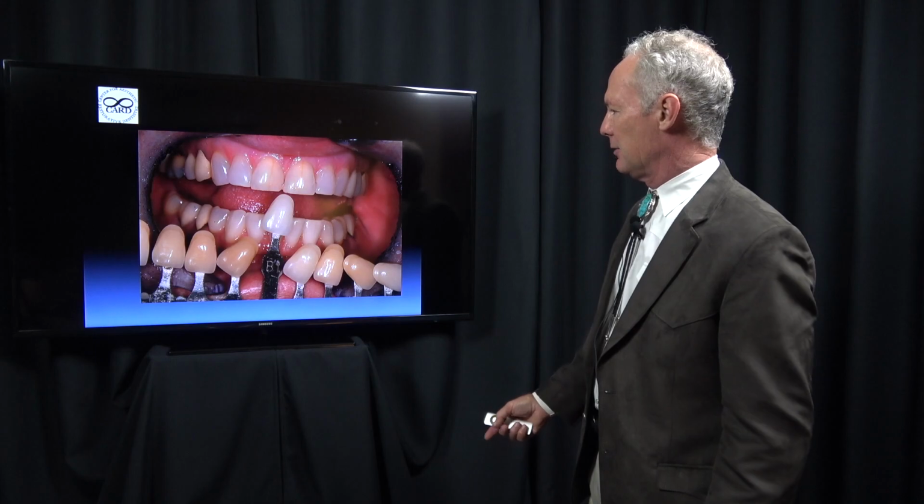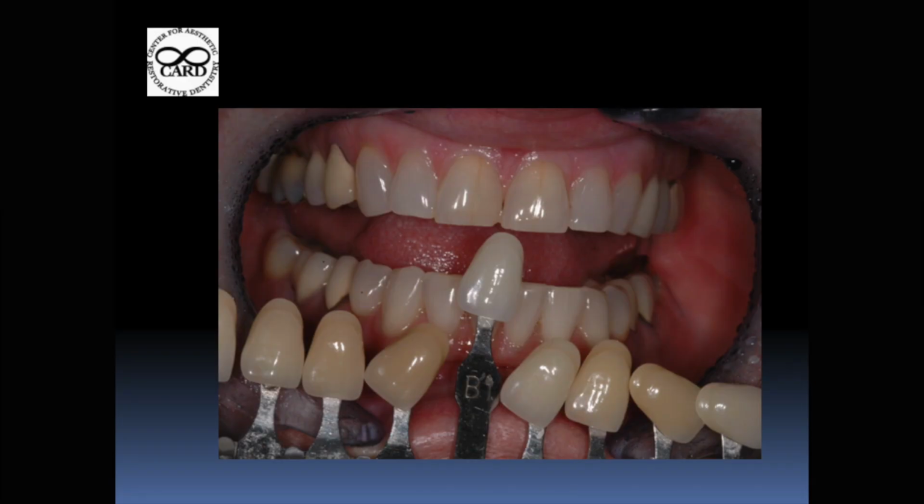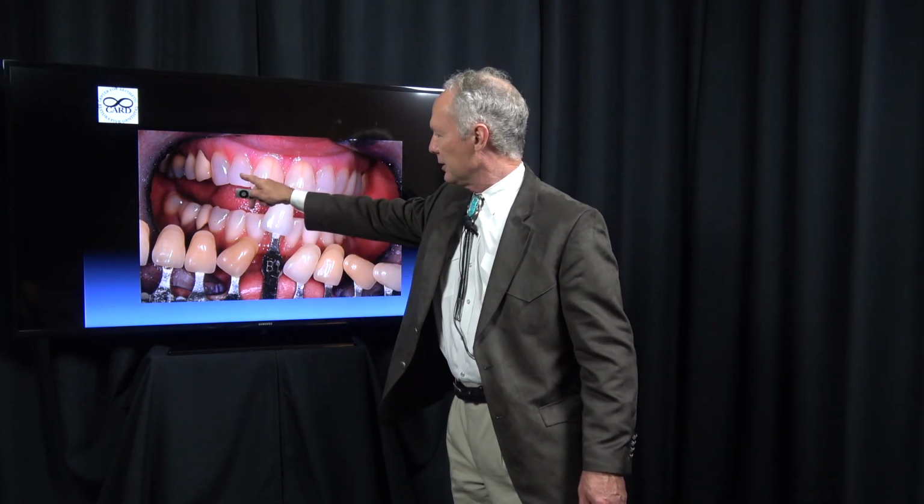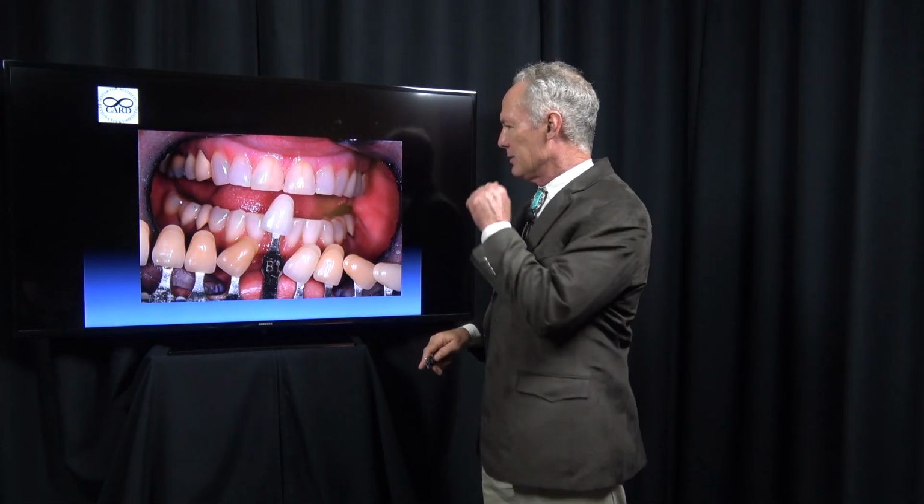Okay, so the first thing I'm going to do is take photographs of the shade guide with the appropriate shade. This B1 shade tab is the shade that most closely matches the adjacent teeth.